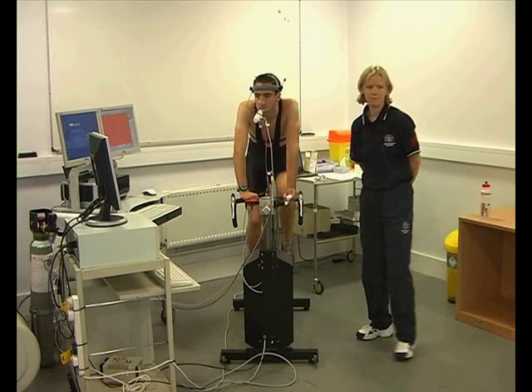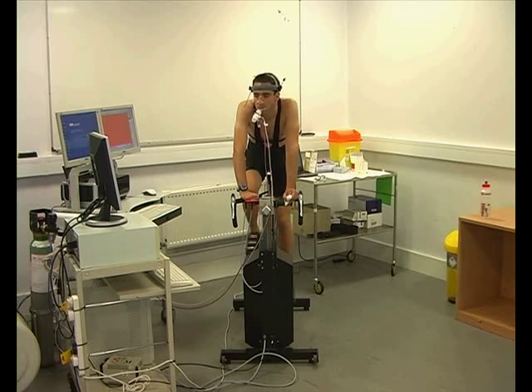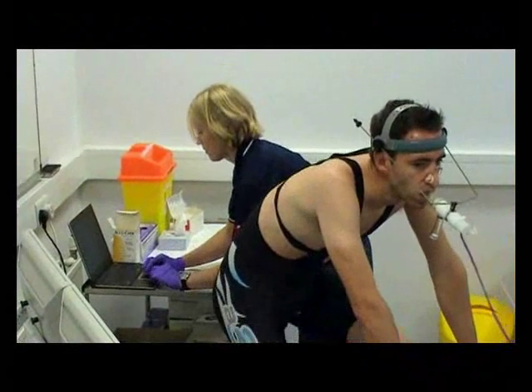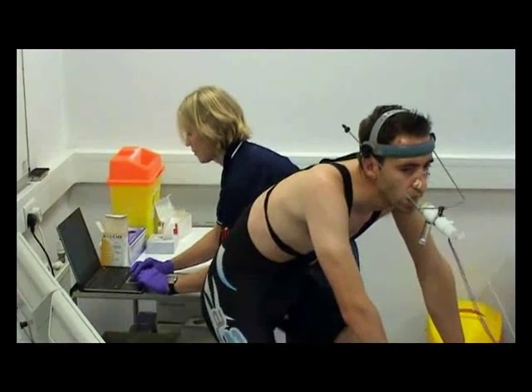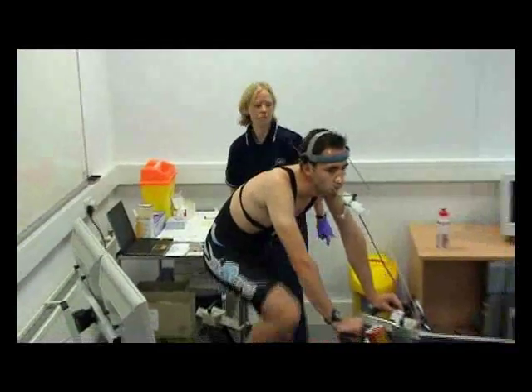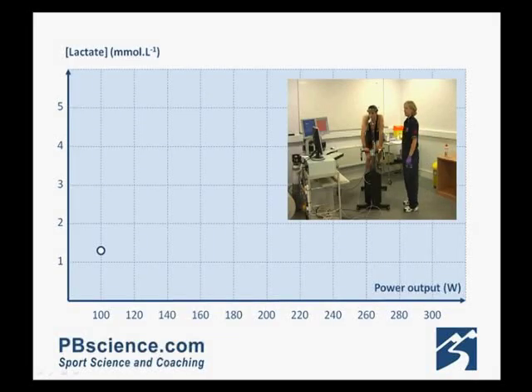The desktop analyses are pretty quick, and the result normally comes through in about a minute. This allows us to get the results and enter them into the laptop pretty much straight away. This is great because we can see where the athlete's lactate threshold is during the test. So let's start plotting our data. Here's the first value at 1.3 millimolar at the end of the 100 watt stage. This is a typical value, close to those seen at rest.